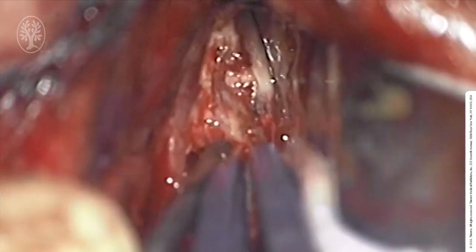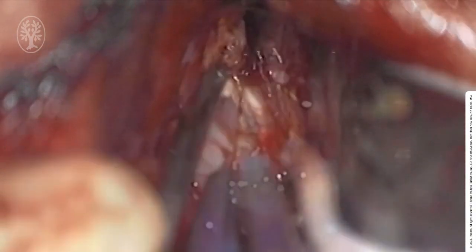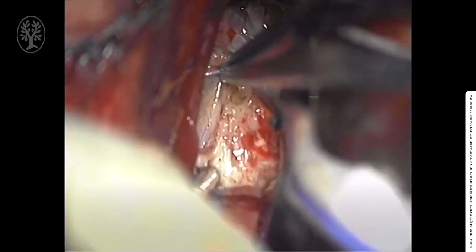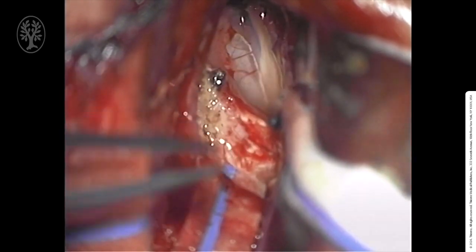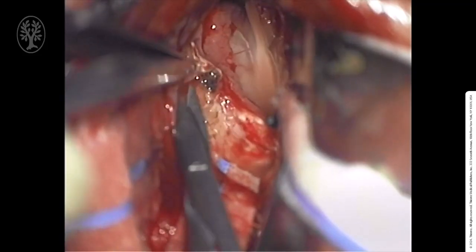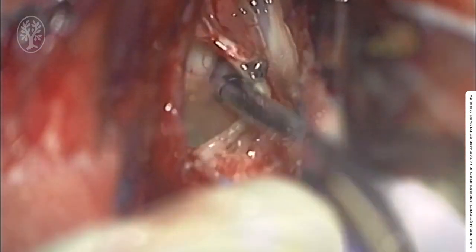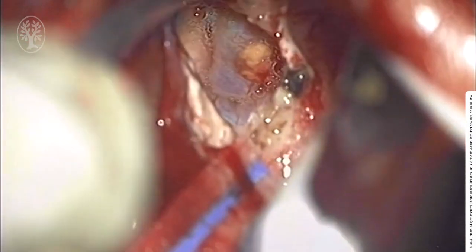We then extended our dissection of the margin between the septum pellucidum and the cyst to allow us to reflect normal tissue laterally and protect the fornices. Here the choroid plexus may be visualized leading into the right foramen of Monroe at the top center of the screen. We then sharply extended our fenestration of the cyst wall and proceeded to further aspirate the mucinous contents. After irrigation, we were able to see the inner content of the cyst.